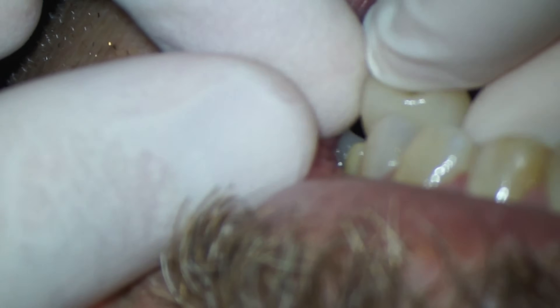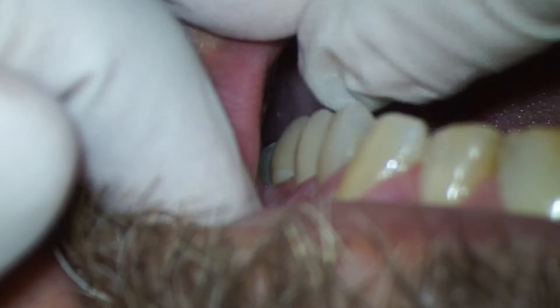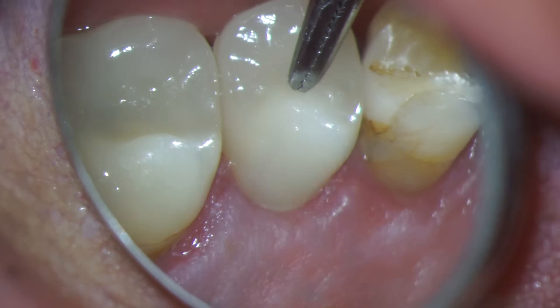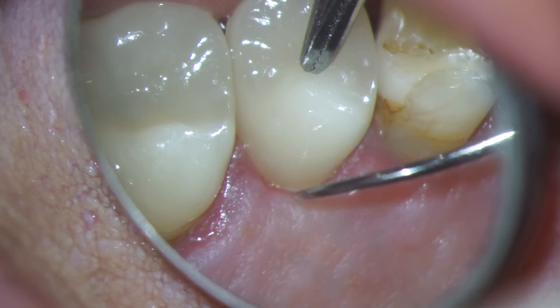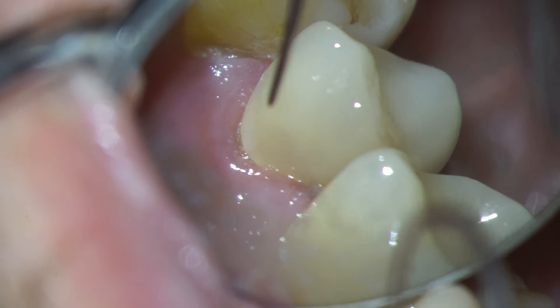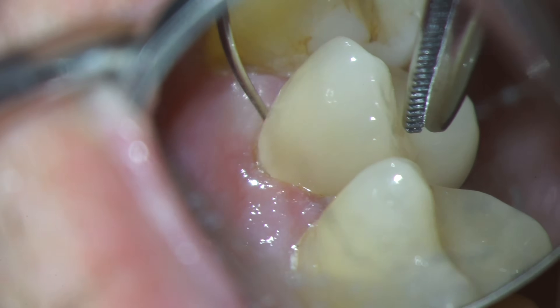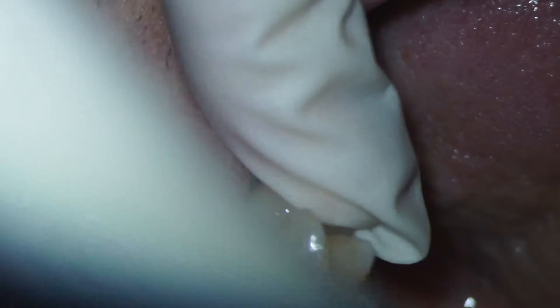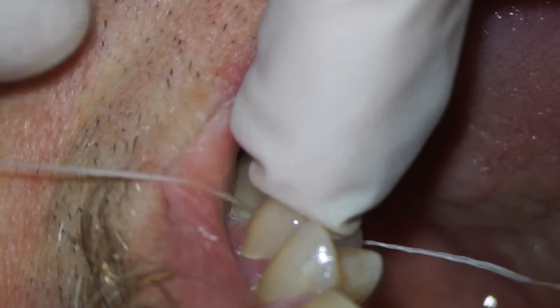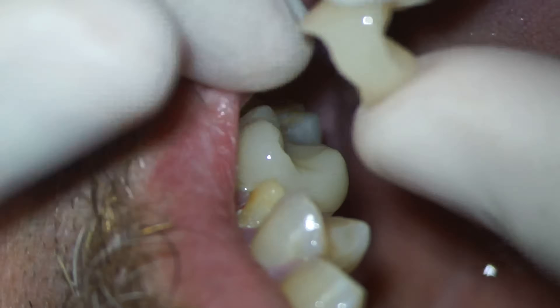So here it is. We're trying it in, making sure everything's fitting well. The tongue side margins are looking excellent — I can feel a perfectly smooth margin between the root and the crown. And the same goes for the cheek side of the tooth. I'm checking the flossing contacts on both sides of the crown to make sure that there's no food traps. All that's left to do is to glue it in. But that, my friends, is a topic for another video.